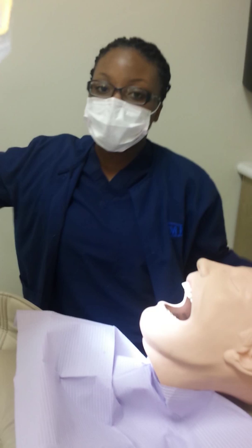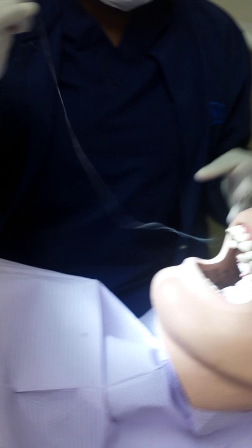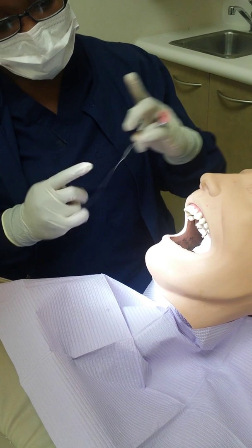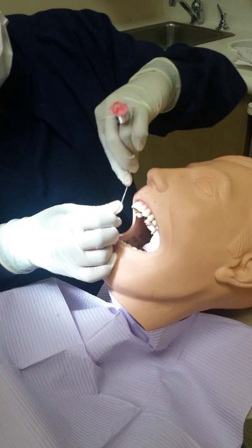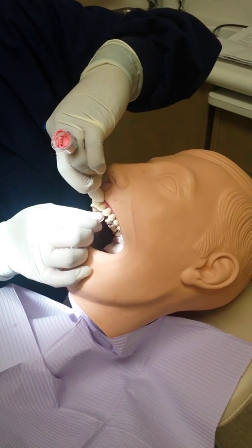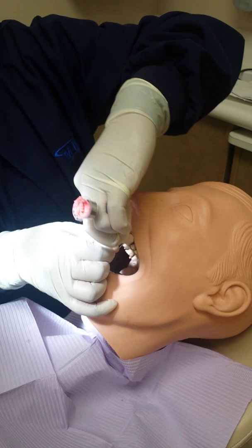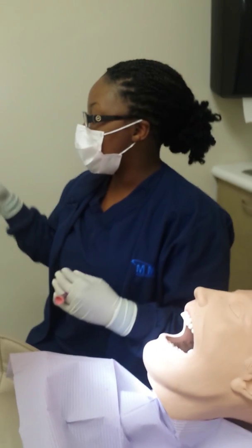Now you use your floss to get any debris or anything that Dexter might have in his teeth out. You would go from side to side, and you would do the same thing for the bottom — so up and down on both sides.